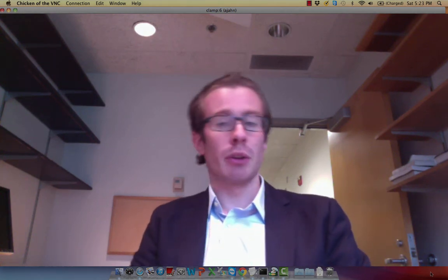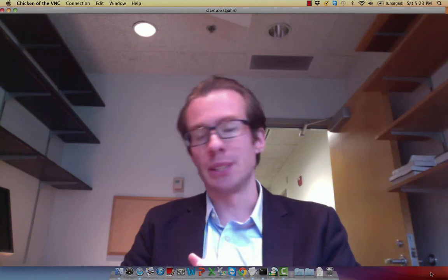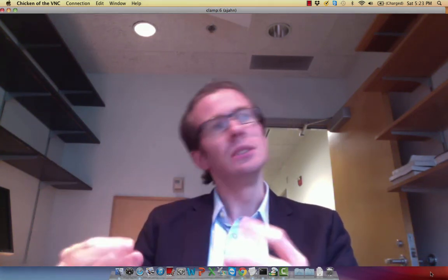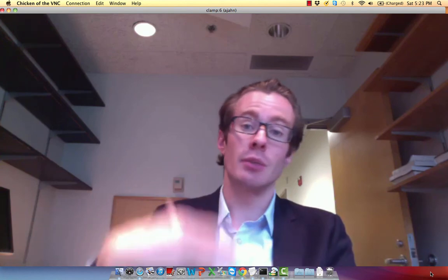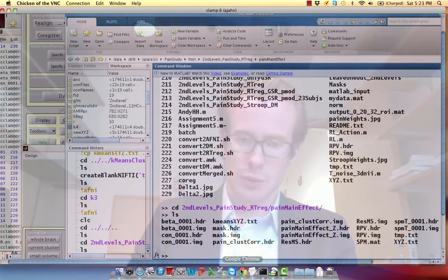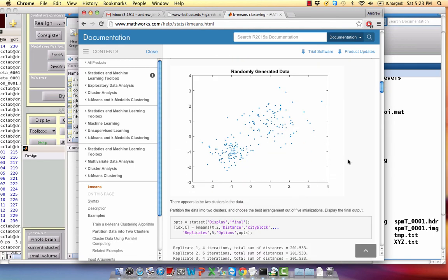Now, this is a rough draft of how I'm applying this right now to a study I'm doing. I don't know if I'm exactly doing it right. Some of the things I'm doing are a little iffy, but I'll walk you through my reasoning and see whether it gives you any good ideas of your own to apply to your studies.